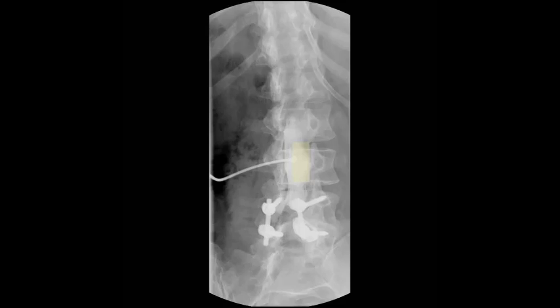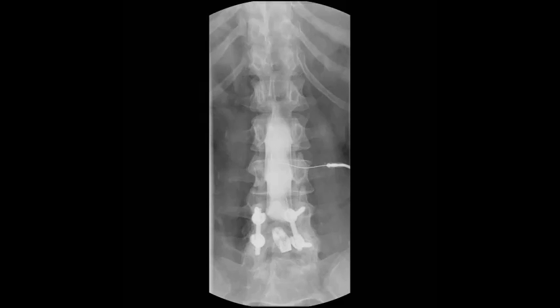On the next frame, I'll show you a picture of my needle position with the patient flattened out and in the AP plane. Because I take a paramidline approach with lumbar punctures, the needle has a tendency to cross midline. That's fine, it's not a big deal. I point this out because I suggest hugging the right side of the interlaminar space. You'll have a shorter distance to travel from skin to target and more chance of ending up closer to midline, presumably a better spot to tap CSF.